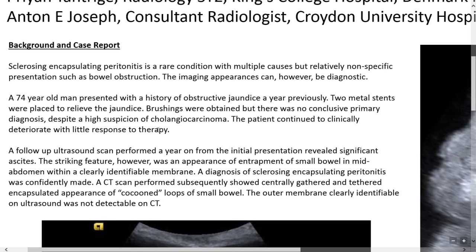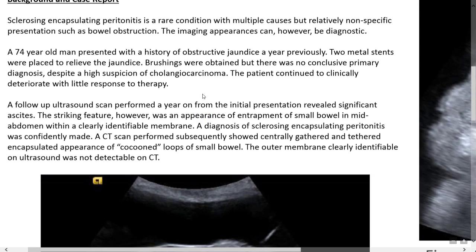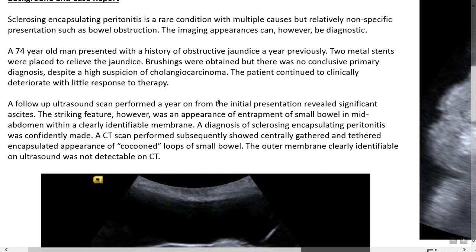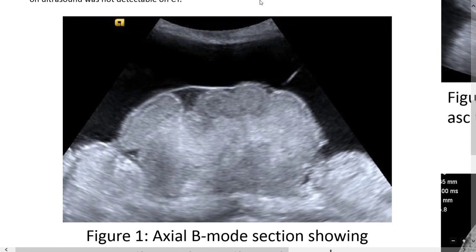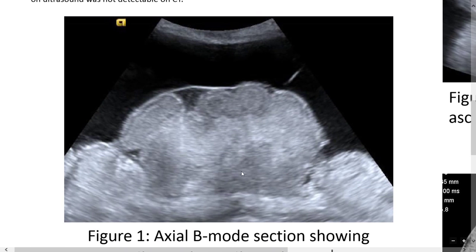There was no conclusive primary diagnosis despite a high suspicion of cholangiocarcinoma. The patient continued to clinically deteriorate with little response to therapy. A follow-up ultrasound scan performed a year on from the initial presentation revealed significant ascites. The striking feature however was an appearance of entrapment of small bowel in the mid-abdomen with a clearly identifiable membrane.